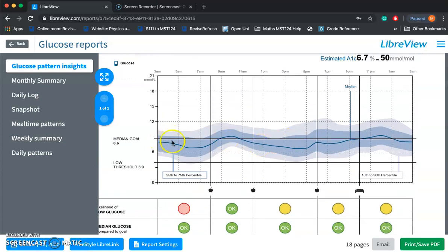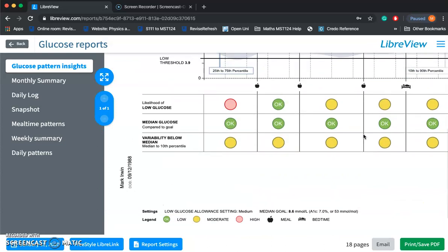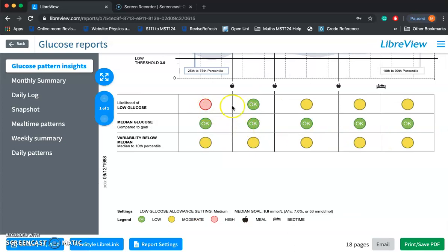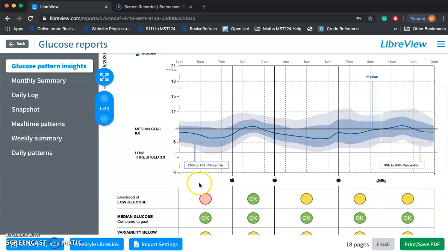Looking at the graph of the past month, I can see I probably need to increase my basal rate between 8 a.m. and 11 or 12, as it's going a little bit high there. It dips during the late afternoon between 4 and 5, and I might need to decrease the basal there because I have been having hypos. Then it tends to go up during the late evening between 11 and 1, so I might need to adjust my bolus rate or look at my carbohydrate ratio at evening meal time. It also gives you the likelihood of having a hypo at particular times — red means a high chance of a hypo.